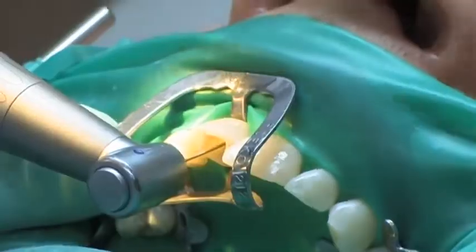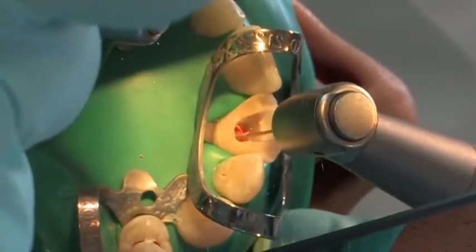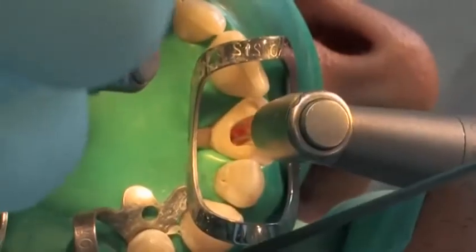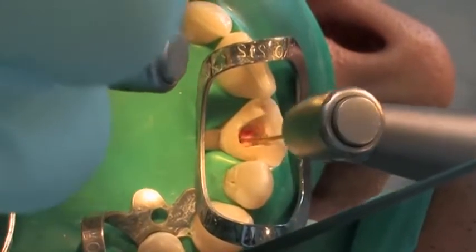The root canal filling material is removed to the predetermined depth using suitable root canal instrumentation. At least 4 to 5 millimeters of root canal filling should remain intact for an apical seal.